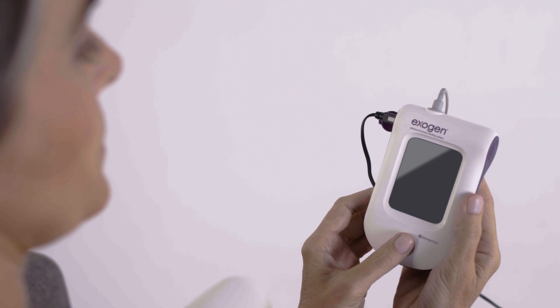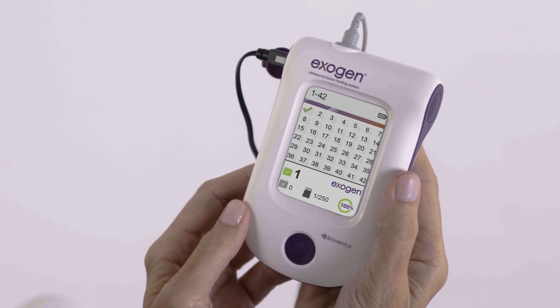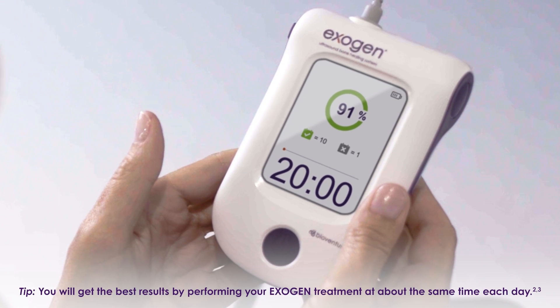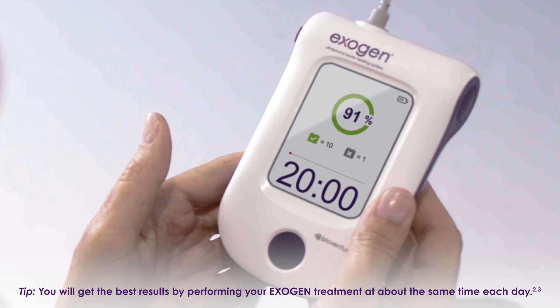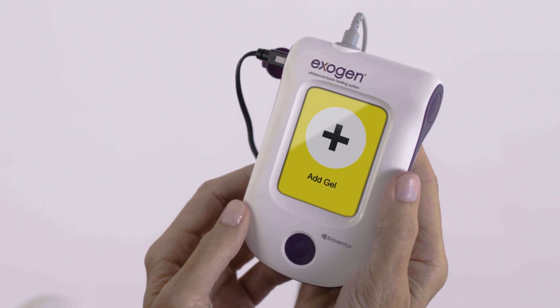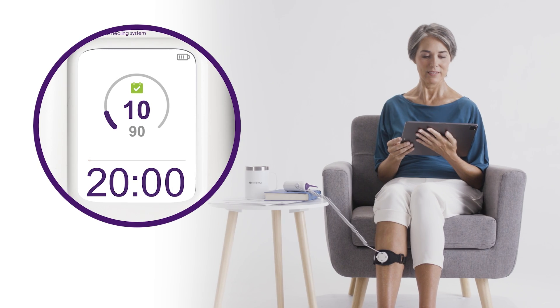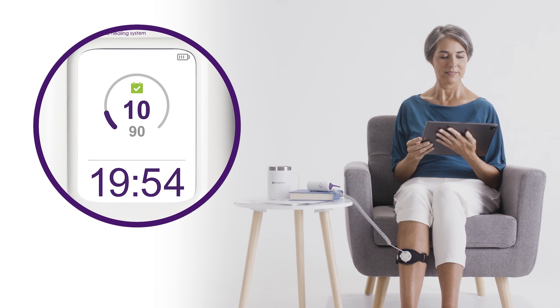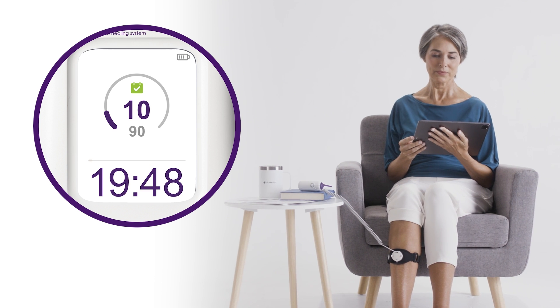For daily treatment, press the button one time to display the startup screen. After two seconds, the log screen will appear along with your treatment summary to date. After five seconds, the 20-minute countdown timer will appear and your ultrasound treatment will begin automatically. If you see a message to add gel, make sure there is enough gel on the transducer and that the transducer is touching your skin. As the timer counts down, you'll see a progress bar with a flashing dot that moves from left to right, indicating that treatment is underway.